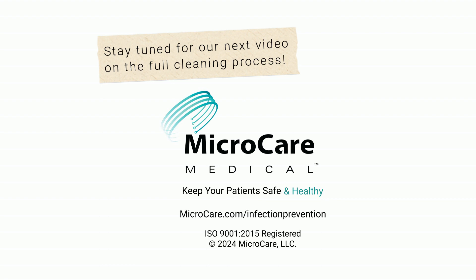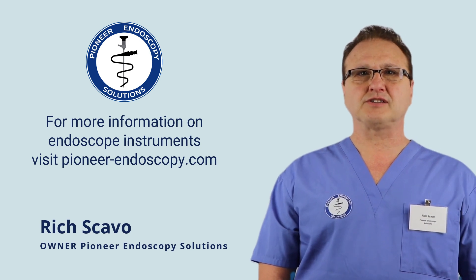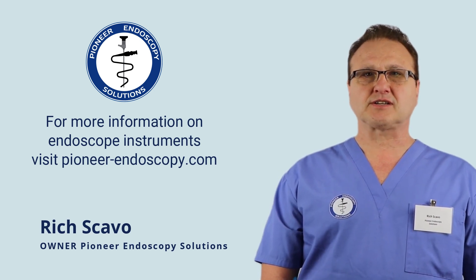And remember, stay clean to keep your patients safe and healthy. Thanks so much for watching How to Clean Your Endoscope with the SPEC Clean Endoscopic Sponge.